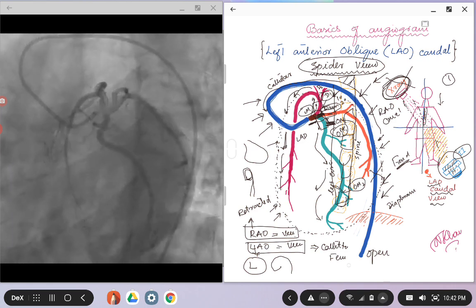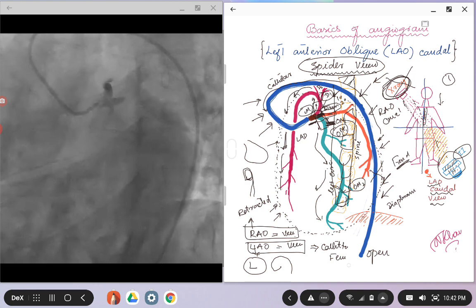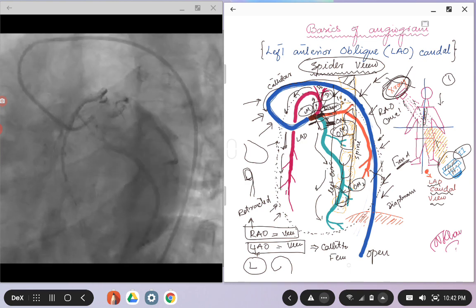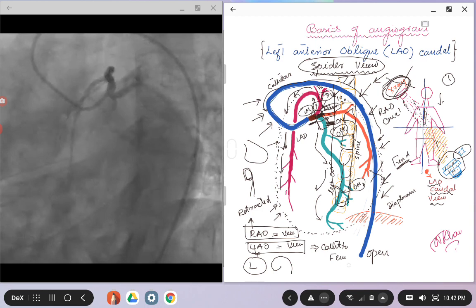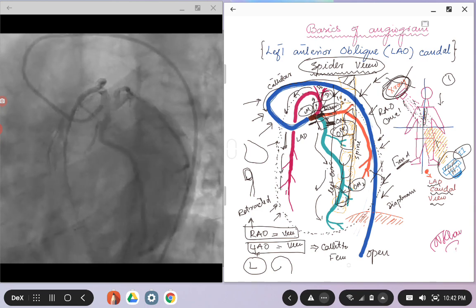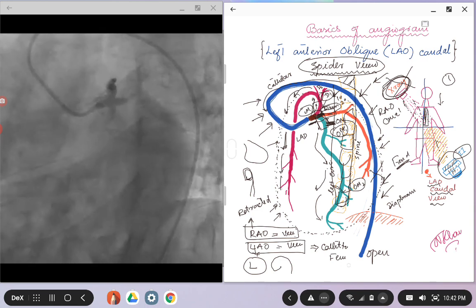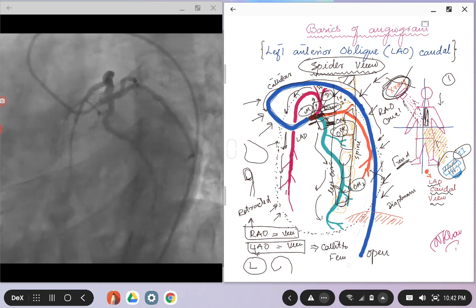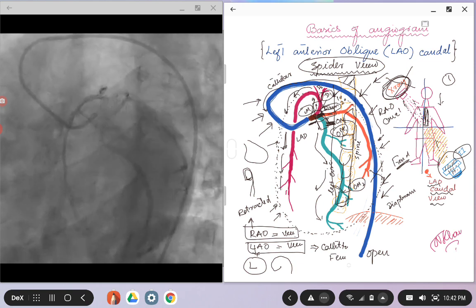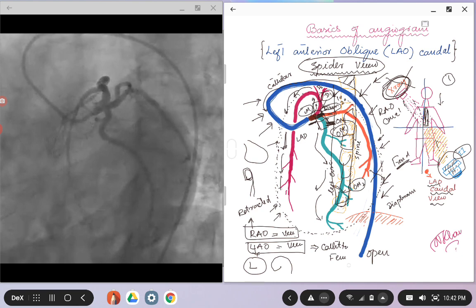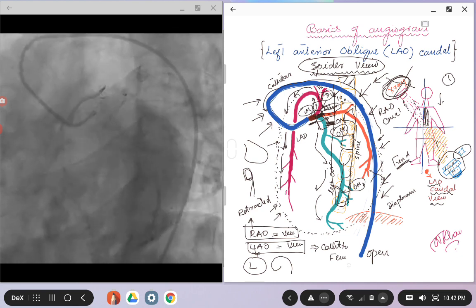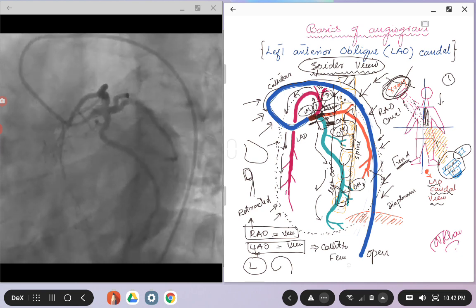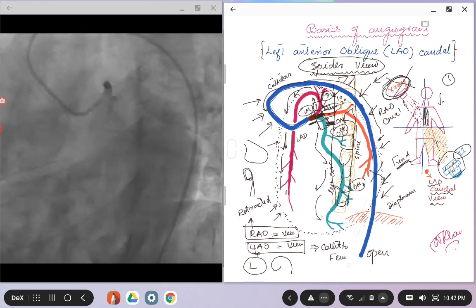This is because the image intensifier is on the right side, but the x-ray is coming from the RAO caudal views. It comes from the body and through the chest, and then it comes across the spine. And when we will talk about the opposite image of the LAO caudal view, like RAO caudal view, the spine will be shifted towards the left.